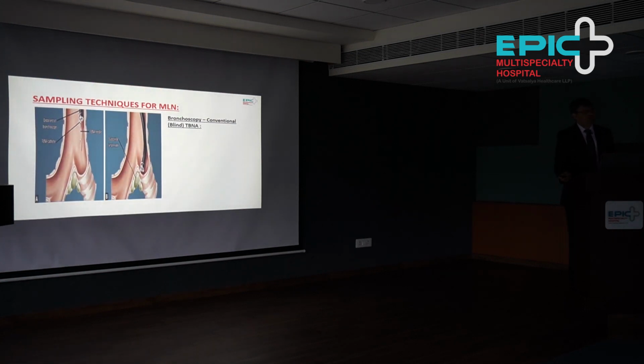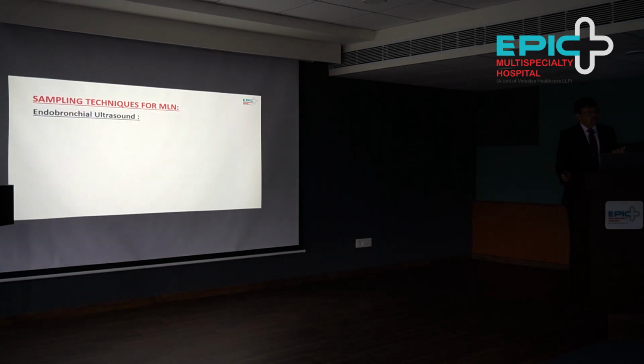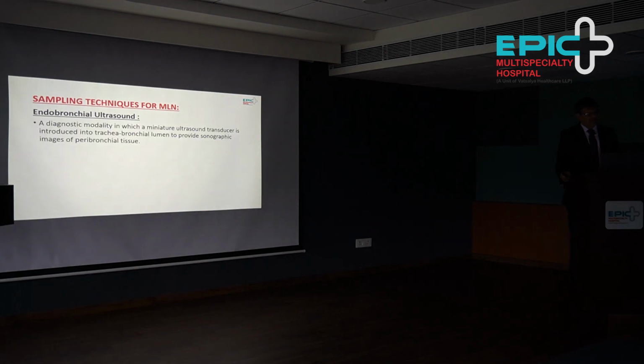The second option is conventional or blind bronchoscopy. As we all know, we can sample a mediastinal lymph node with conventional bronchoscopy, but it is a blind procedure. The limitation is that it has limited access only to station 7, and it has less yield, because we are not sure where we are puncturing, whether we are going inside the lymph node or not. And then there is an obvious risk of inadvertent injury to the great vessels, because we don't know where we are heading with the needle. So there comes the role of endobronchial ultrasound.